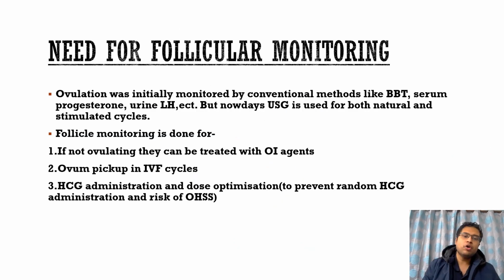What is the need for follicular monitoring? So ovulation was initially monitored by conventional methods like basal body temperature, that is rise in the body temperature at the time of ovulation or around the time of ovulation, serum progesterone levels and urine LH levels, which indicated LH surge. But nowadays ultrasound is used for both natural as well as stimulated cycles.